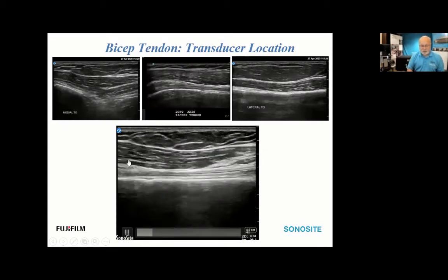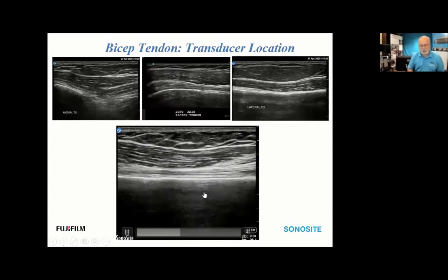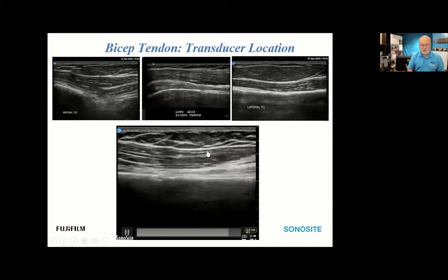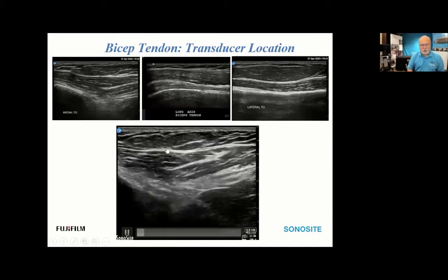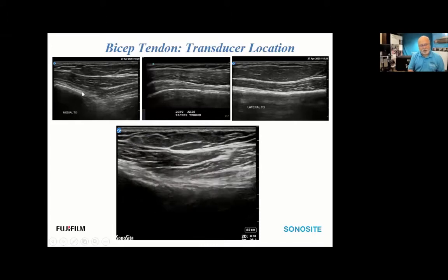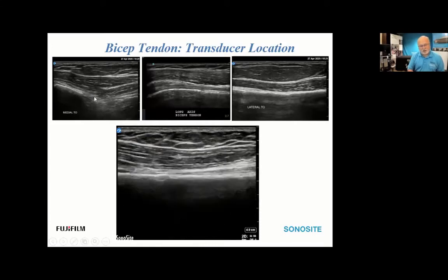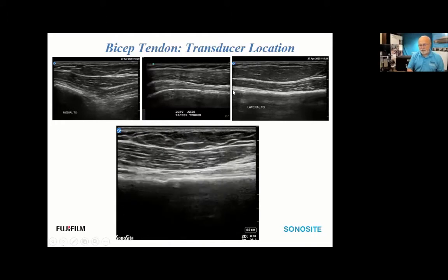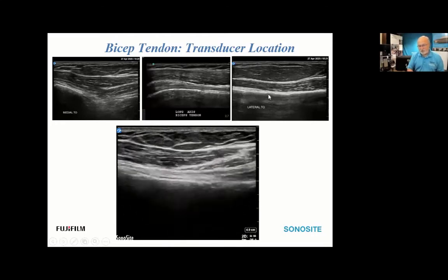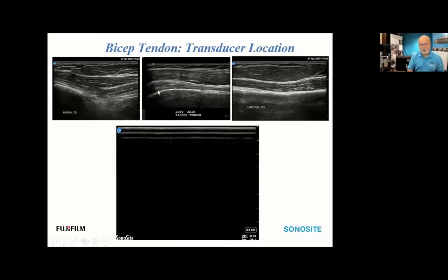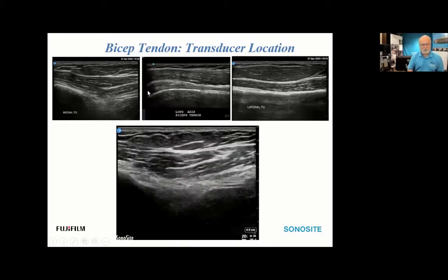The bicep tendon can be a little difficult to locate when you're just starting. One pearl: if you're medial to the bicep tendon in a longitudinal plane, the echogenicity of the bone disappears distally. If you're lateral to it, the bony signature remains present all the way down. So if you see bone all the way down, slide the transducer slightly medial to encounter the bicep tendon fibers; if medial, the bone falls off.